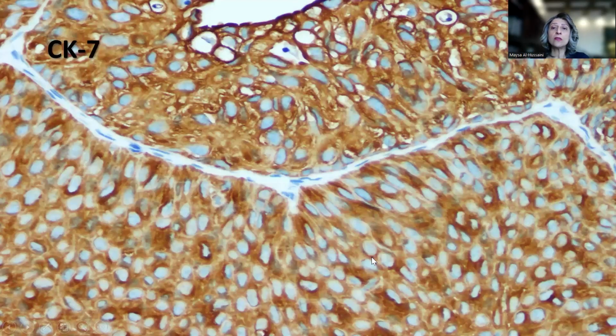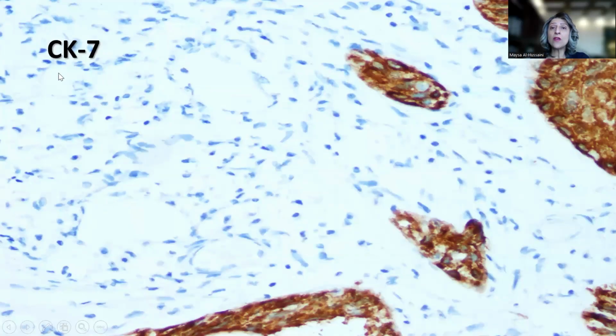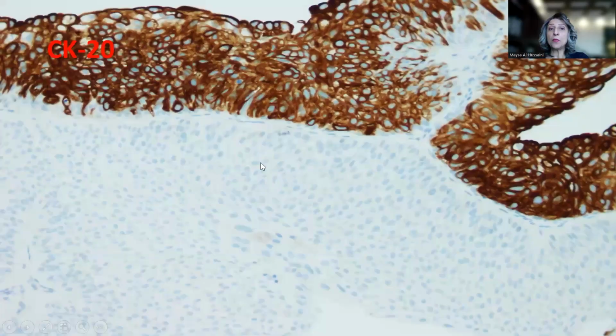Now, into immunohistochemistry: cytokeratin 7 is positive in both the low-grade component as well as the high-grade component. What cytokeratin 7 was useful for is to highlight further the areas of invasion into the lamina propria. But what was really beautifully showing is the cytokeratin 20, in which the low-grade component was completely negative, whereas in contrast, the high-grade component showed full thickness positivity with cytokeratin 20.